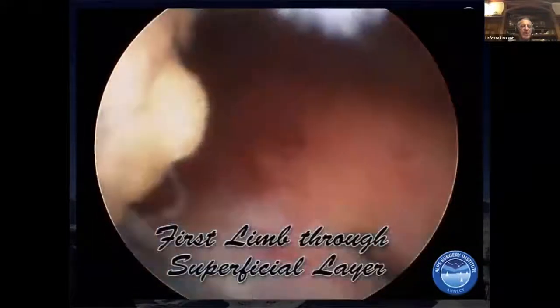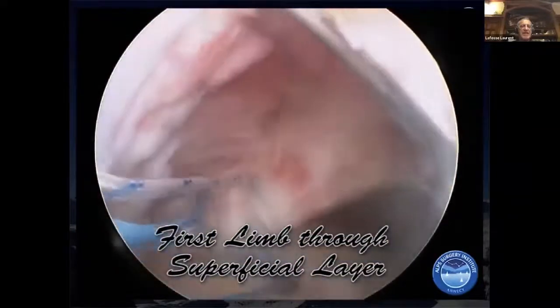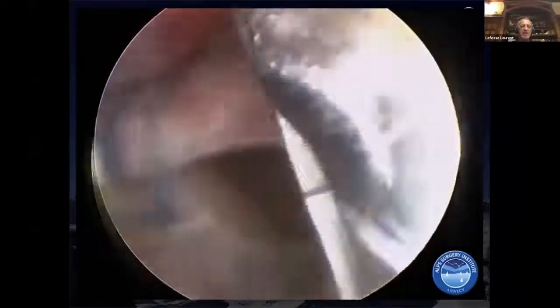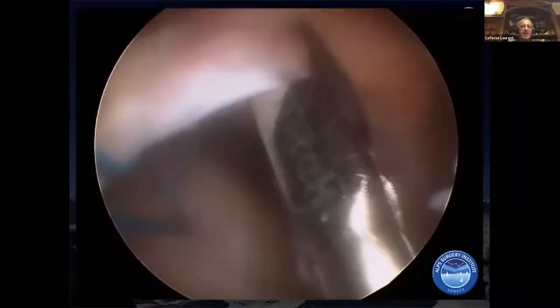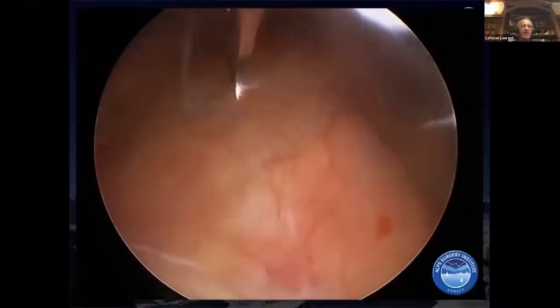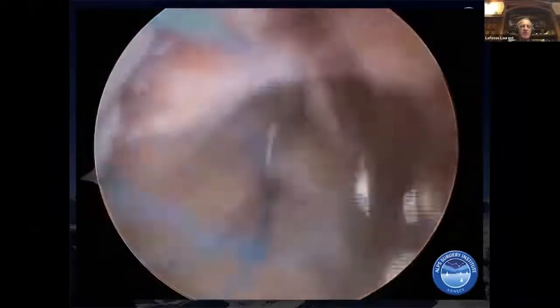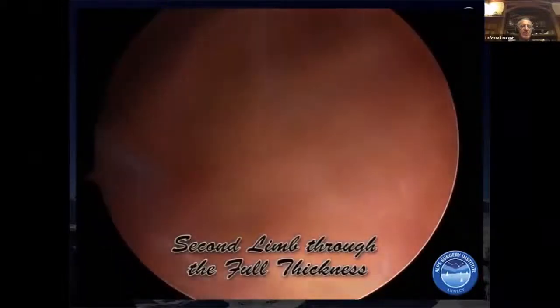What about the superficial layer? I use the same suture, same thread. But here I restore it at a different level because I restore the anatomy this way. And you see here that we restore, with the deep level here, the superficial layer, by going through the superficial layer to capture the suture which has been used to manage the lasso loop of the deep layer.